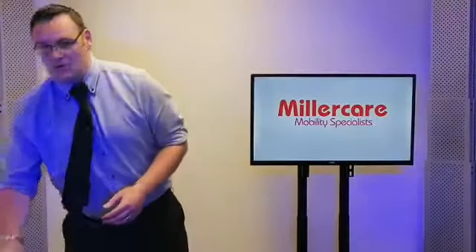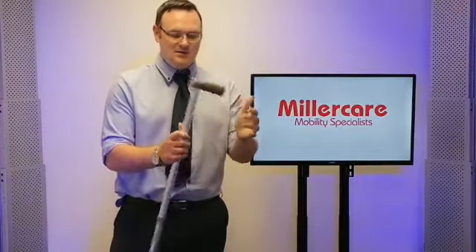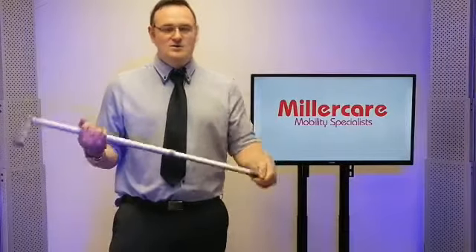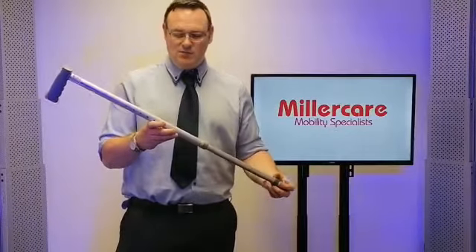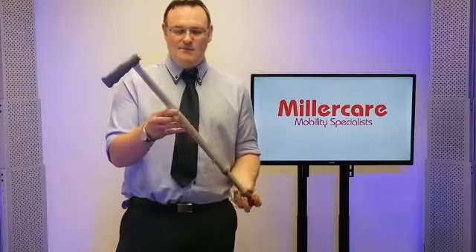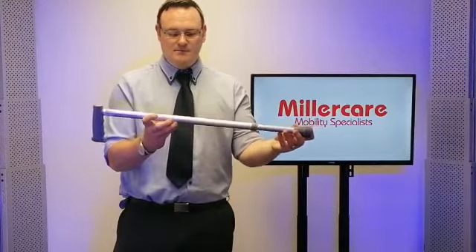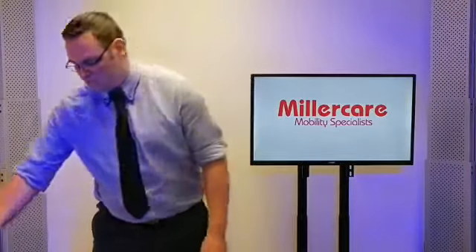First we're going to look at the humble walking stick. Top end has a nice plastic grip, and the bottom end has a nice heavy-duty ferrule used to stop people from sliding about. We've also got a level of adjustment in the walking stick where we can adjust the height with just a pop-lock system to find the perfect height — looking for a nice straight posture so the person's not hunched over and they're also not reaching up to their elbows.